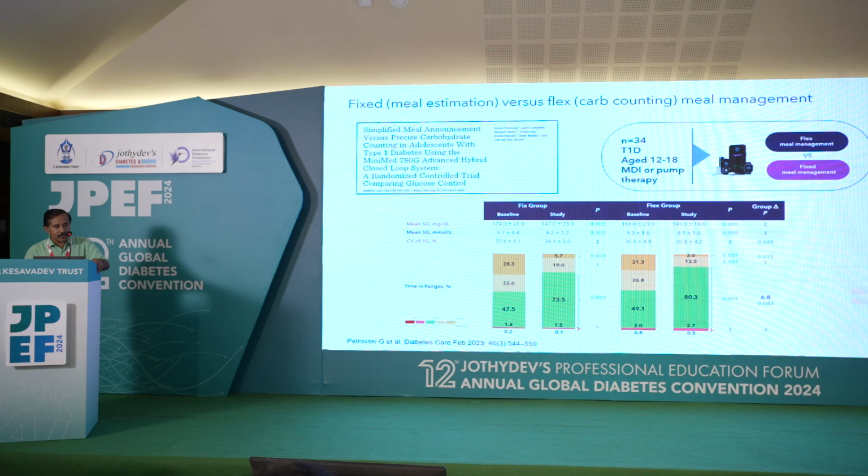So this study, which Dr. Vinay has also shown, tells us about fixed meal estimation. That is what most of us are using, because when we are using the multiple daily dose injections and blood glucose estimation using the glucometer, what we do is the same, the fixed meal thing.